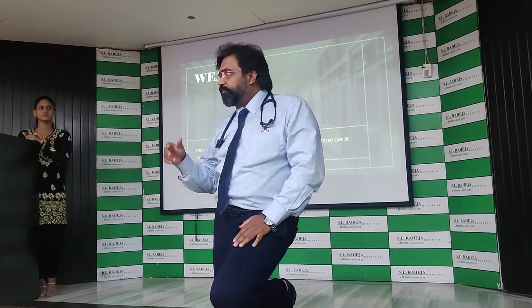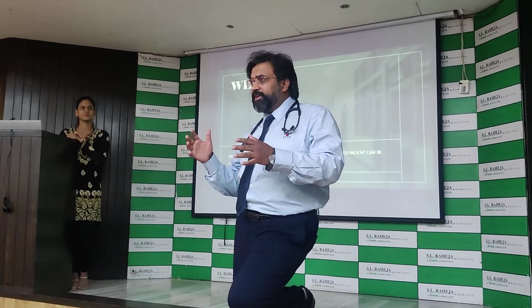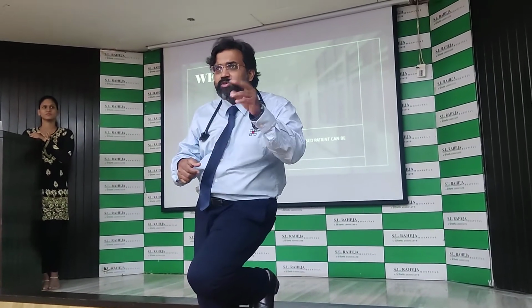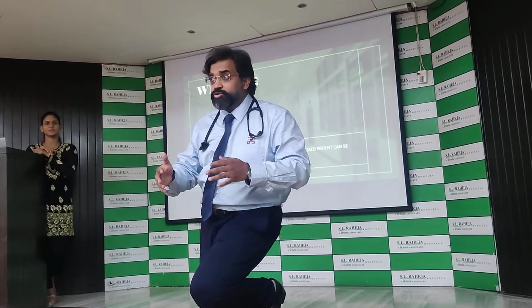Now 3 days have passed, 4 days have passed. The patient's whole process is getting better and better. He starts breathing on his own also. You don't have to change the ventilator from this to pressure support. You don't have auto trigger. You don't have all those things. Asynchrony comes down because you don't have to do anything.